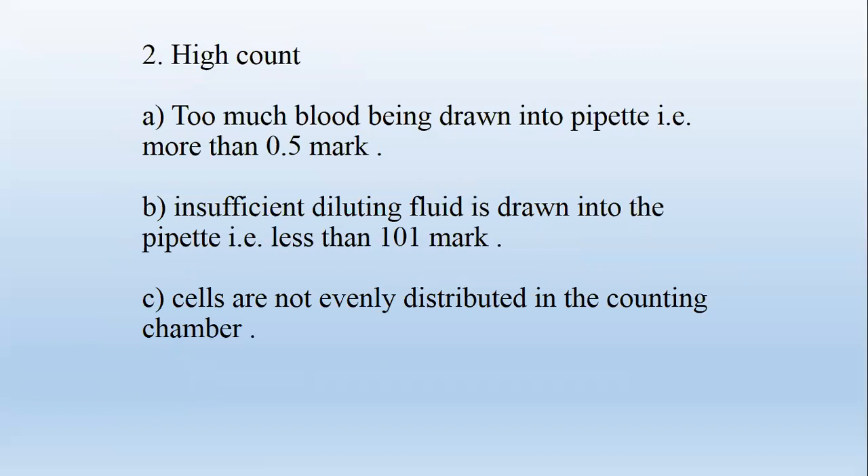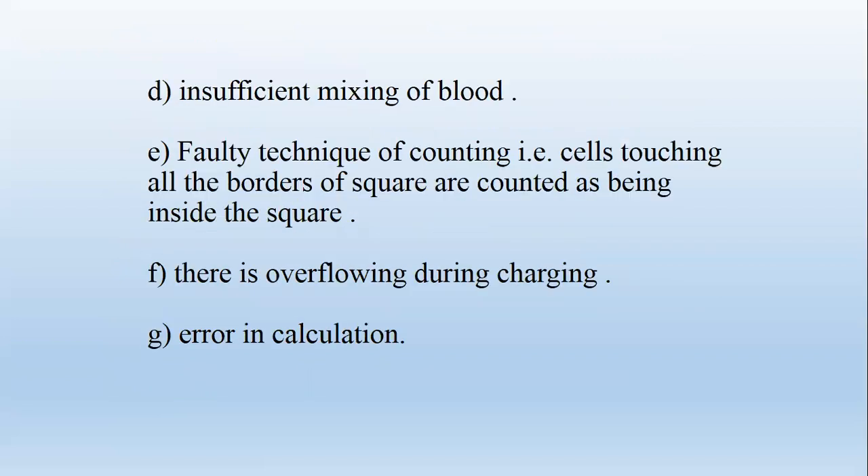High count results from: too much blood drawn into the pipette, i.e., more than the 0.5 mark; insufficient diluting fluid drawn, i.e., less than the 101 mark; cells not evenly distributed in the counting chamber; insufficient mixing of blood; faulty technique of counting; overflowing during charging; and errors in calculations.